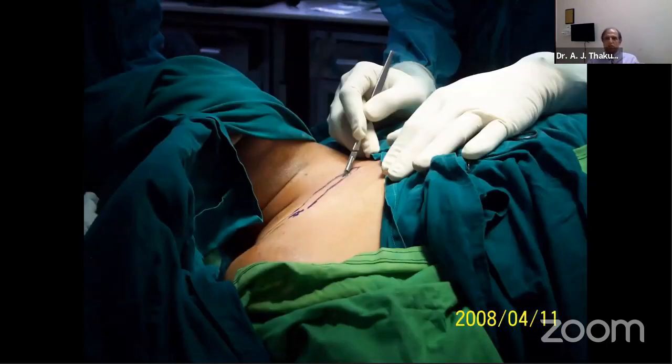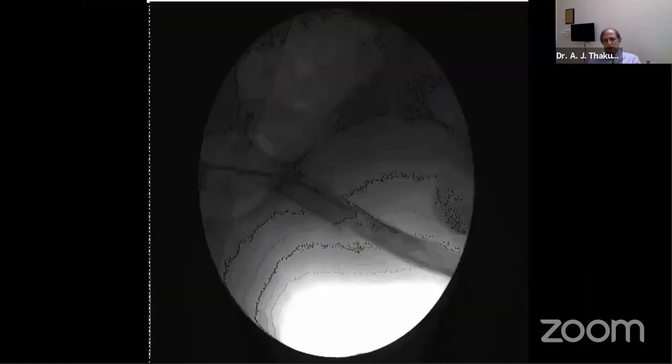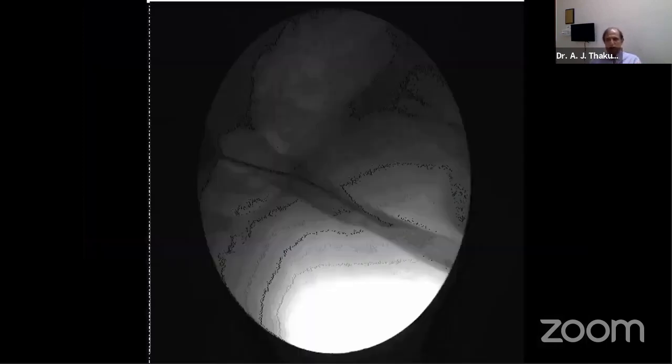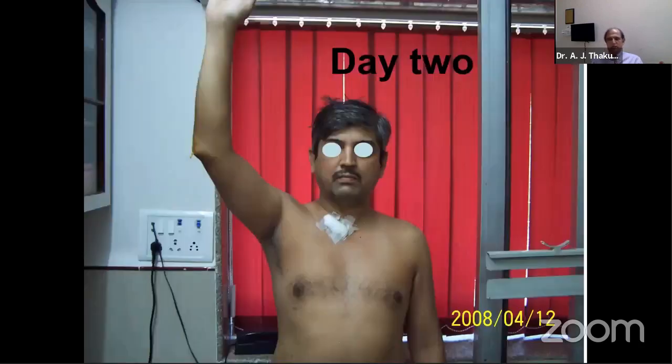There we are. The entry is from the medial side of the clavicle. A small drill hole is made, and the wires are passed. You can see the wire progressing across the fracture site. And all this can be recorded by just turning the image intensifier at every step, this way and that way, as I showed to you. And the fracture is stabilized there.